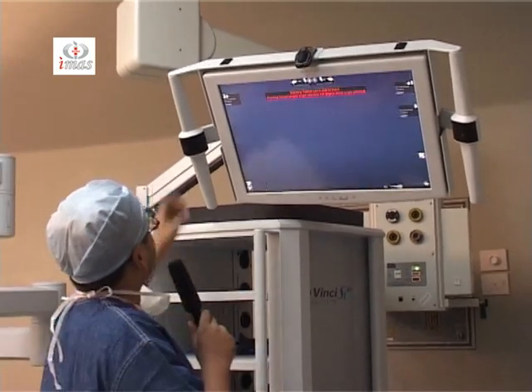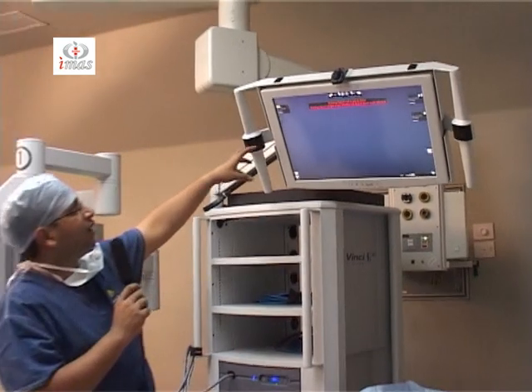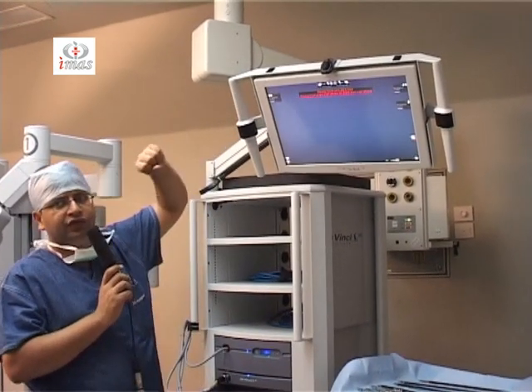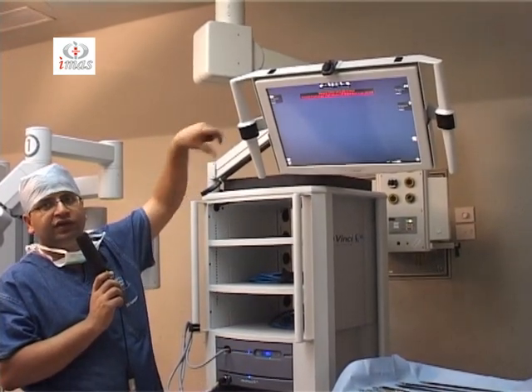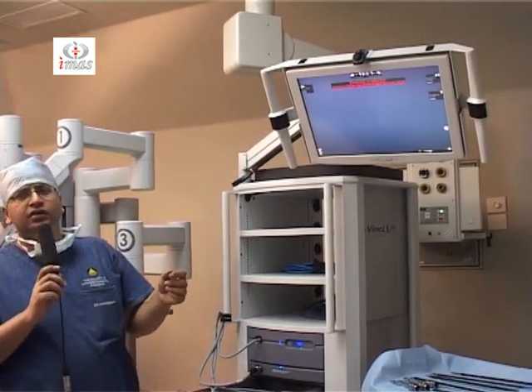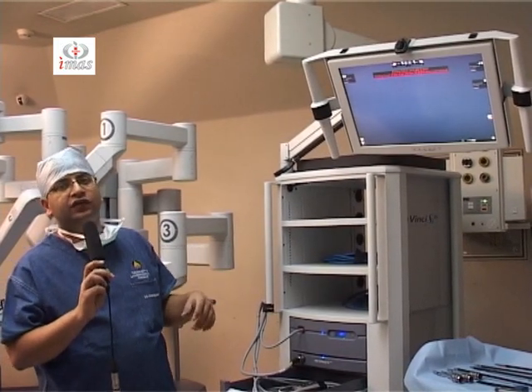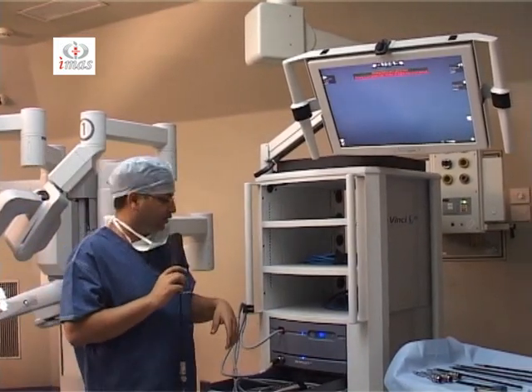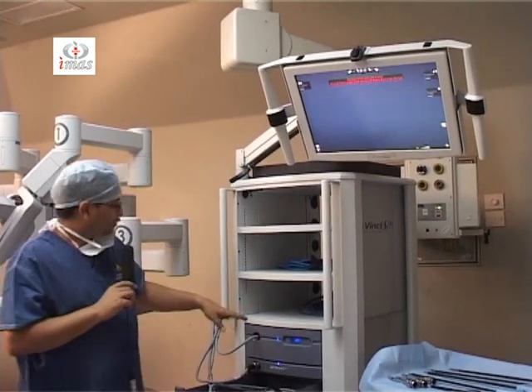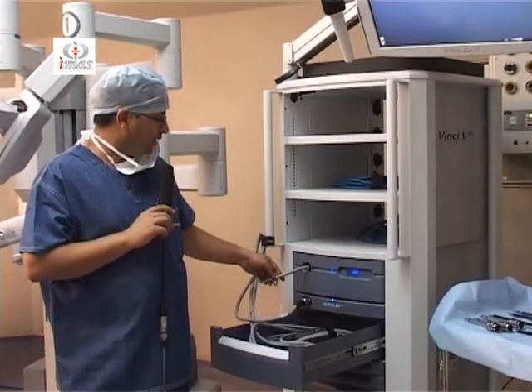These are the speakers from which whatever the surgeon speaks comes out, and this is the microphone from which whatever is spoken by the assistant is carried on to the master console. So this can help in distant surgery. If the master console is away from the patient cart, even then the communication between the surgeon and the assistant is not hampered. This is the illuminator, in which this is the light cable.